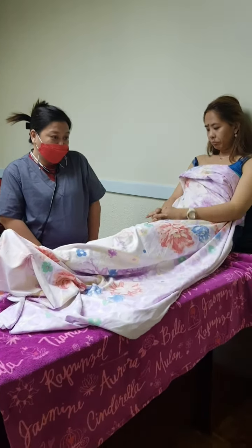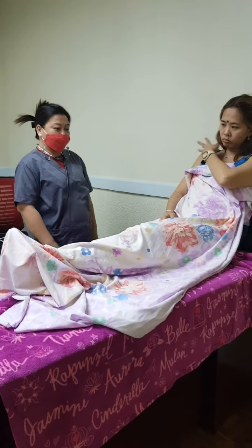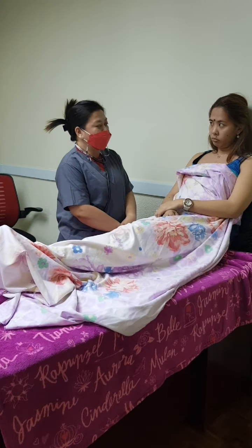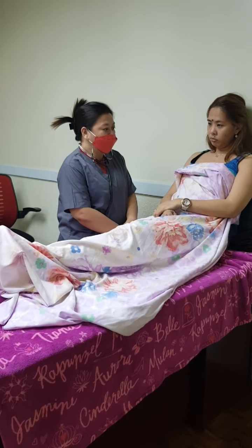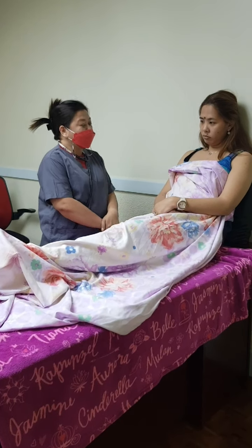Assess the client's abdomen. Assessment determines presence of bowel sounds and amount of abdominal distension. Good afternoon, ma'am. I'm Liza. I will do an NGT for you, ma'am. Is it okay with you?